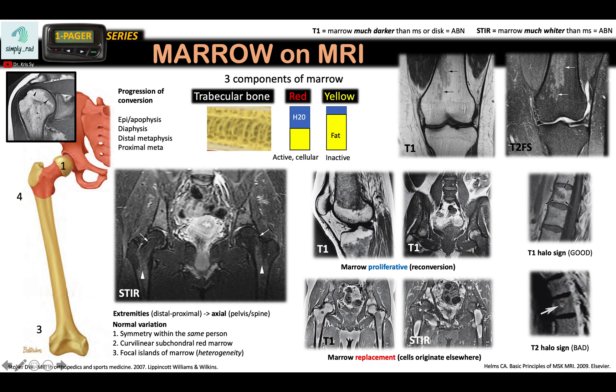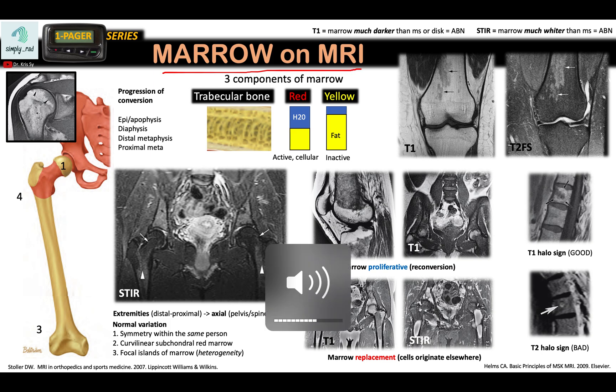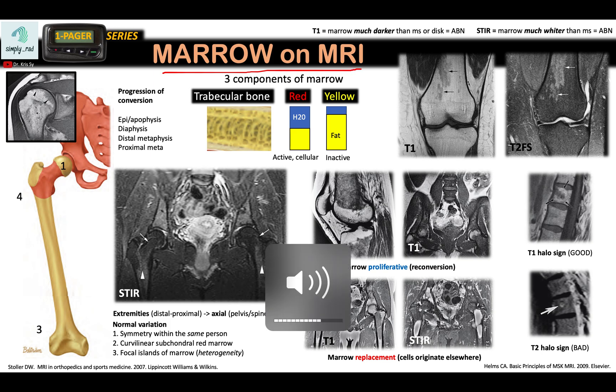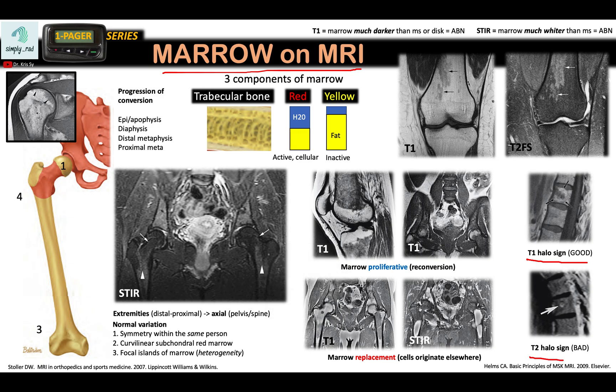To continue our talk about marrow on MRI, we're going to examine the T1 halo sign and the T2 halo sign.